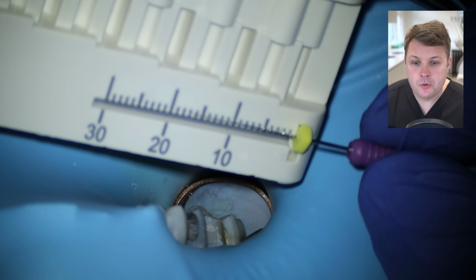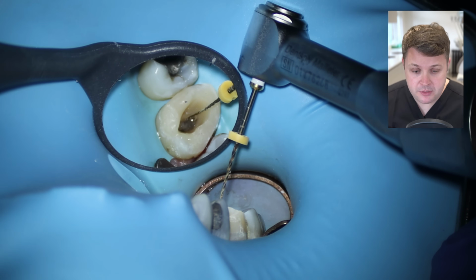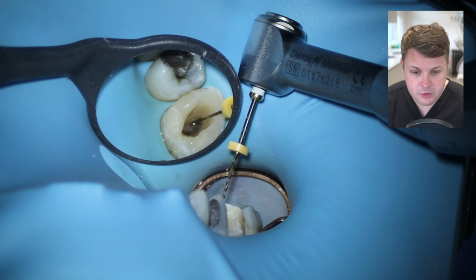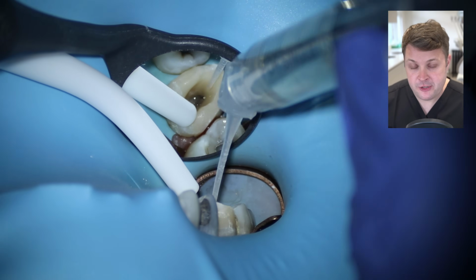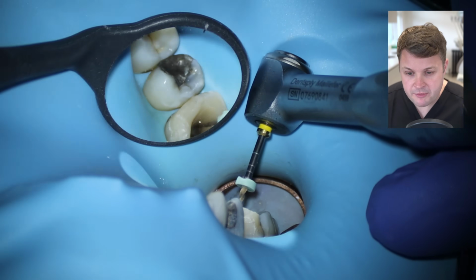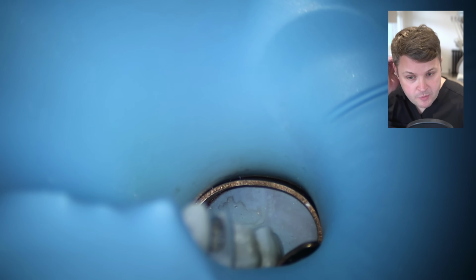So I'm just going to open up the MB2 canal orifice again with our high diameter files. It's really, really simple. So when you're doing this yourself and you feel like you're not getting to length, always open up the coronal to mid-thirds with high diameter files, but don't go too far. And in this case, I'm using a size 15 and a size 20. I'm slightly worried about using a size 25 to open this up. A lot of the times with the MB2, I don't like to shape it up to a size 25.